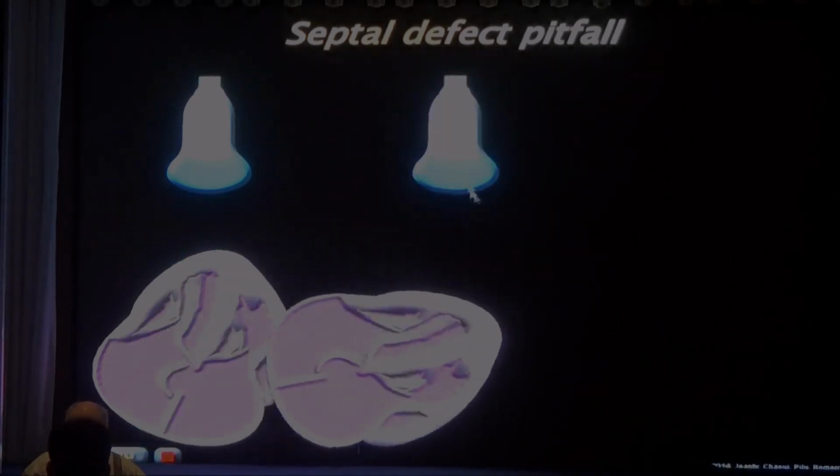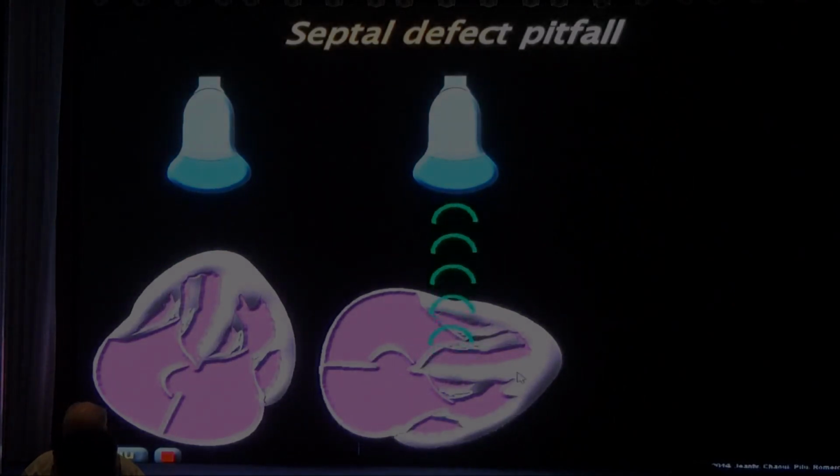If you look at ventricular septal defect, and you look in an apical view, which is what we often use when we do fetal echo, the interventricular wall is going to be almost parallel to the ultrasound beam. And if the beam is parallel, it has no interface to reflect on. So the machine will have no signal to write, and the machine will write a dropout artifact. It would put a black hole that looks like a ventricular septal defect. So avoid doing an apical view, go instead in a transcostal view, and now you are perpendicular to the interventricular septum. And then you have a good reflector.